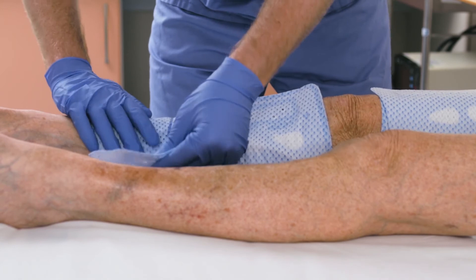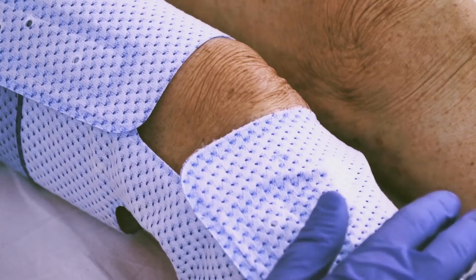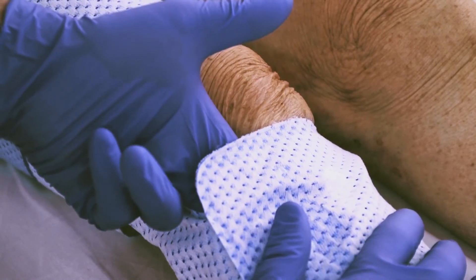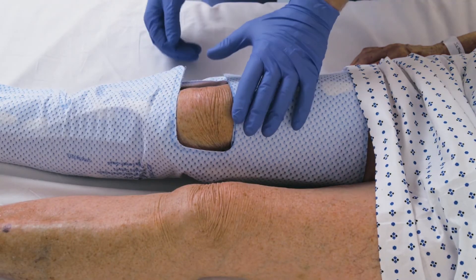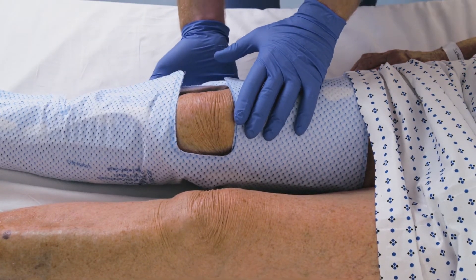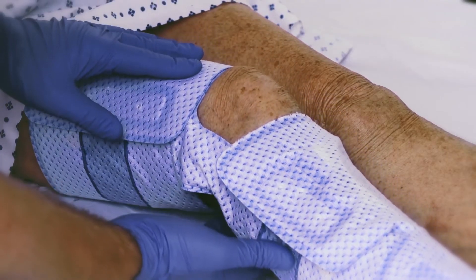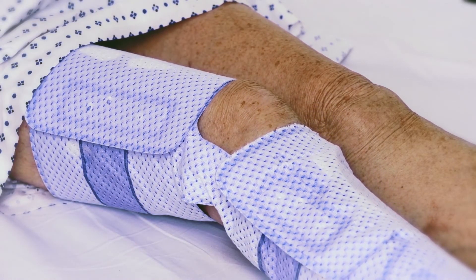Make sure to leave approximately two fingers of space between the deflated sleeve and the patient's leg. Ensure the gap in the thigh length sleeve is positioned at the patient's knee to avoid compression at the popliteal area.